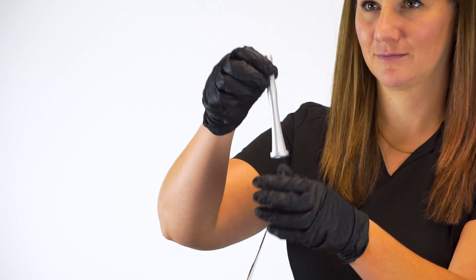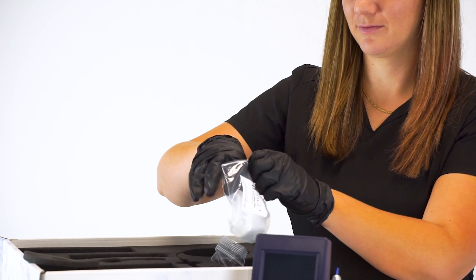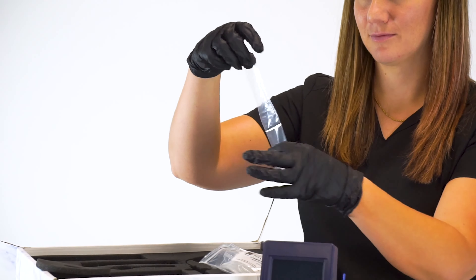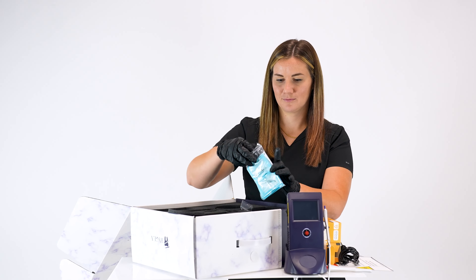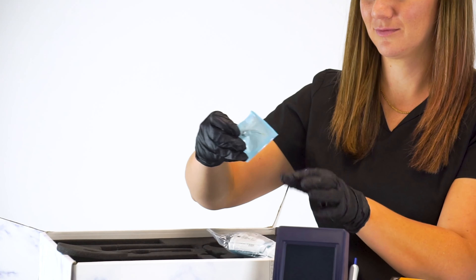One therapy handpiece, one pack of 50 handpiece barrier sleeves, and a 30 pack of 400 micron disposable tips.